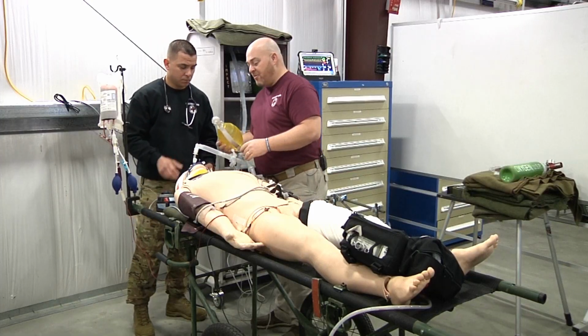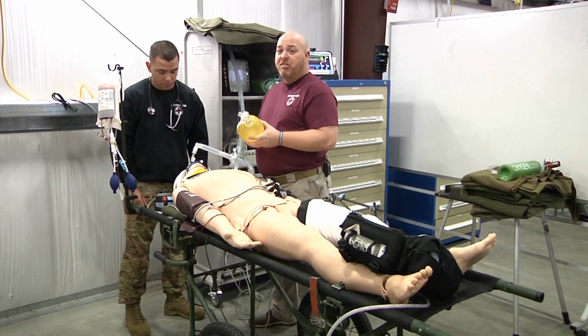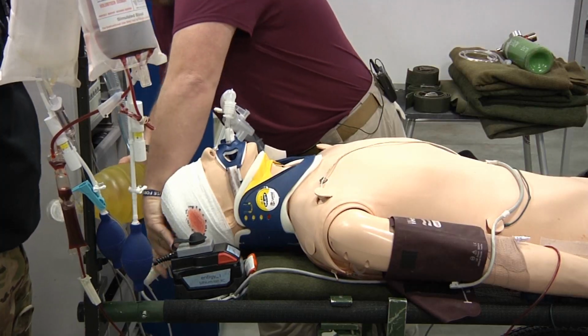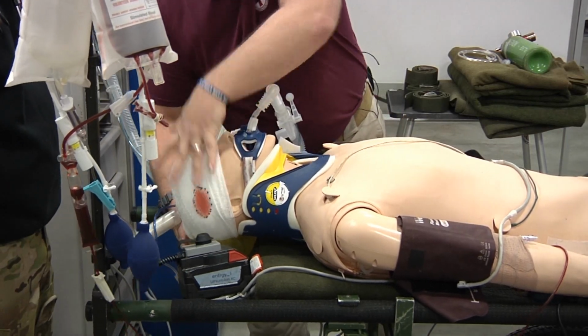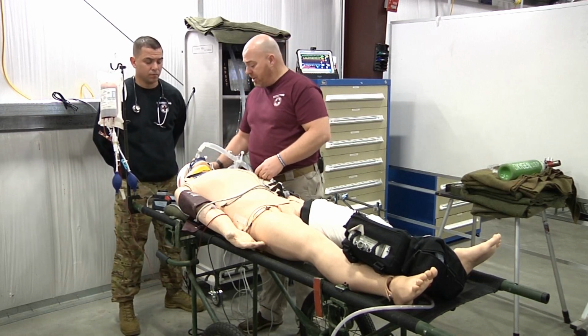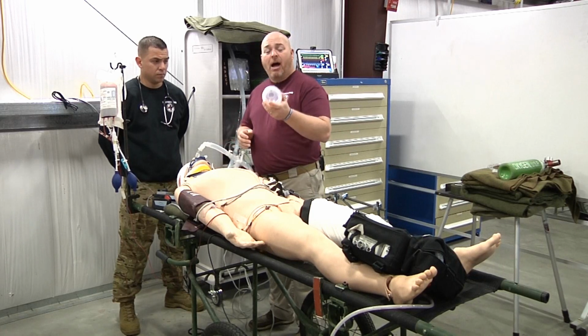The patient is back on the vent. Now, a great place to put this tool, the same one you use, the same one that you tested with, is underneath the patient's head. It provides a little bit of inline stabilization, and whoever's handling your airway will always know where the BVM is, okay?